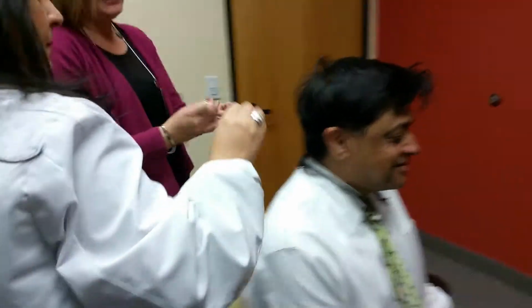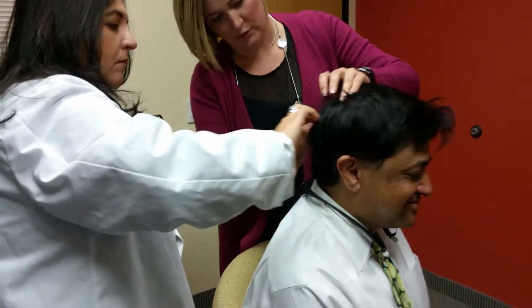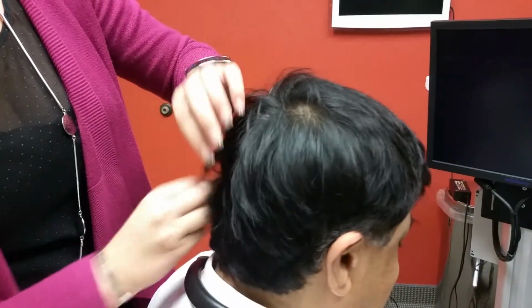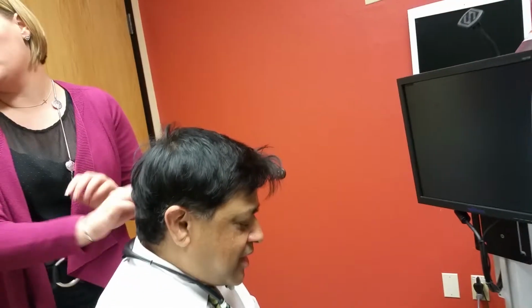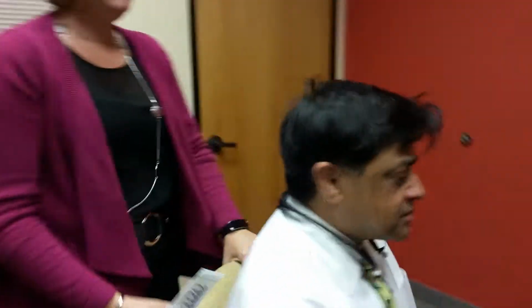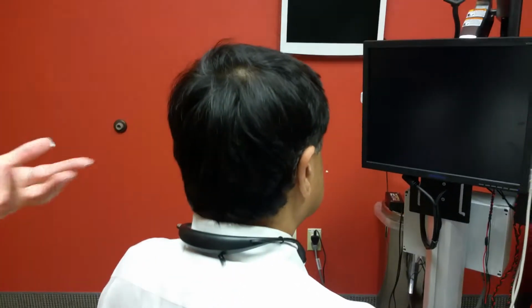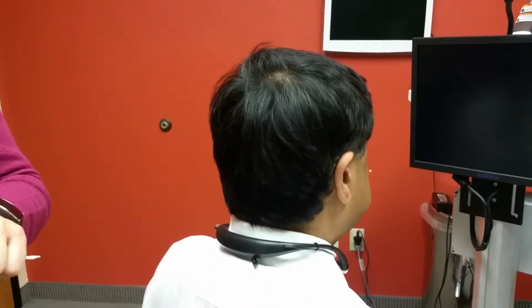So you see how this is still wet? We want to make sure that we really get in there and scrub, because if that's wet, our sticker's not going to stick. And then I'll also show you a trick for people who have long hair. So you can see, chin up nice and level for me. His hair's kind of fluffy, so whenever we walk away, we're going to lose our spot.